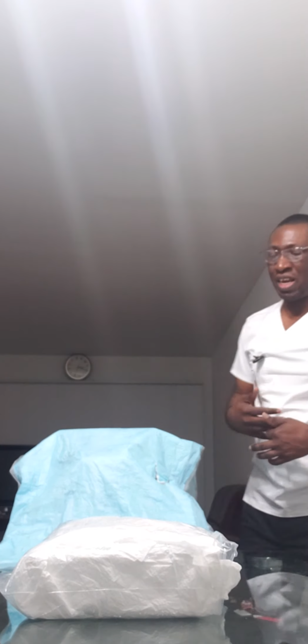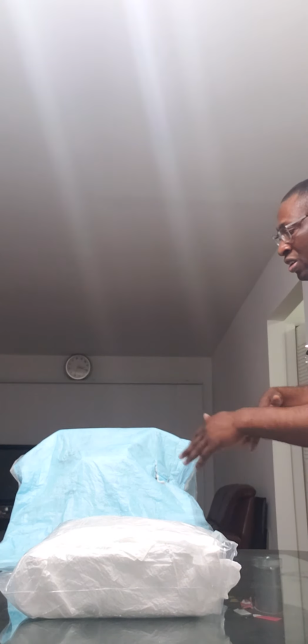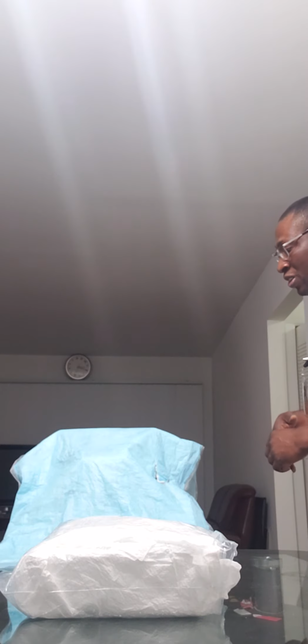All right. Hi, Amanda. Please, can you join me here? Please, can you assist me? All right, thank you. They'll come back to my patient, and I have to position my patient. But before I do that, I'm going to help change you and clean you up, change the pad to avoid any infection contamination, okay?